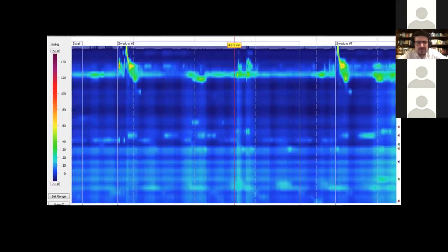As with all manometries, not everyone looks the same, so you have variations of this, but all you're going to see is no contractility. For all the subtypes of achalasia, you always have this condition of having no normal motility during the study. You never saw a normal swallow. So this applies to achalasia type 1: essentially a total aperistalsis of the esophageal body, coupled with a failure of the LES to relax.